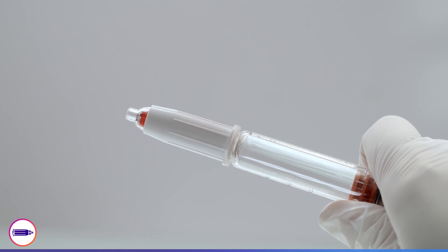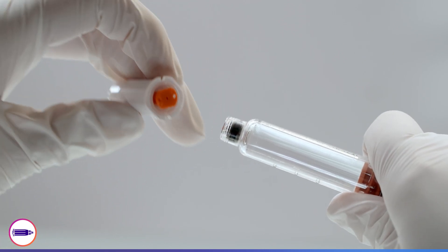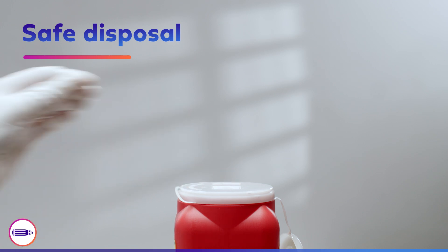The safety shield is now locked in place for your safety and the pen needle is safe to remove. Hold the white sleeve of the pen needle and twist it off. The pen connection end of the needle is now protected with an orange shield. Dispose of the pen needle in a sharps container.